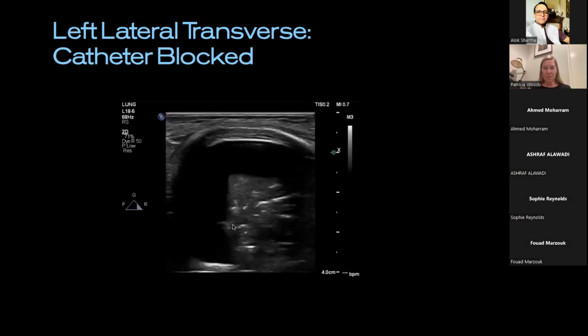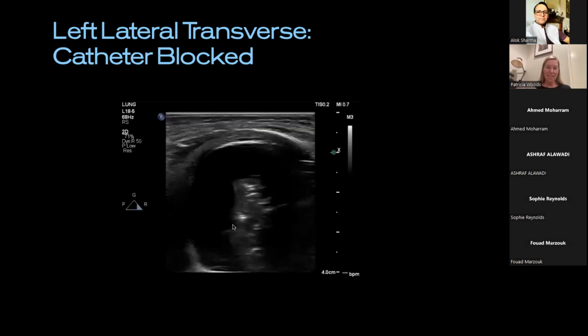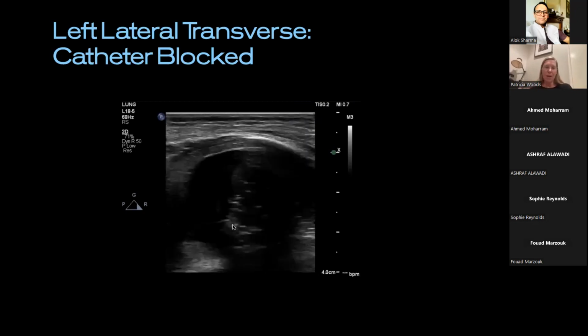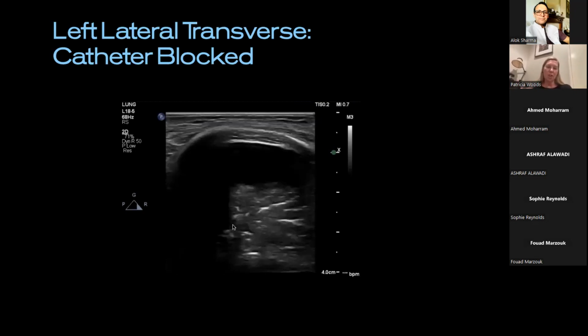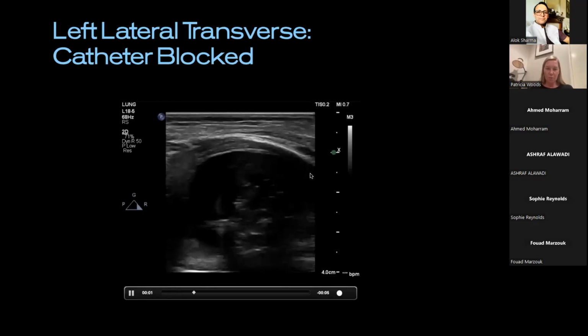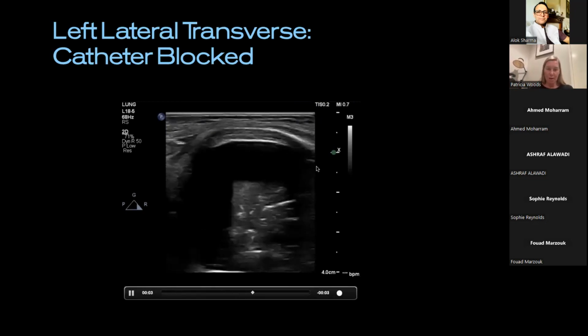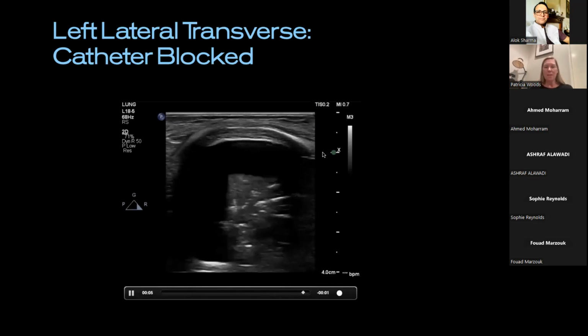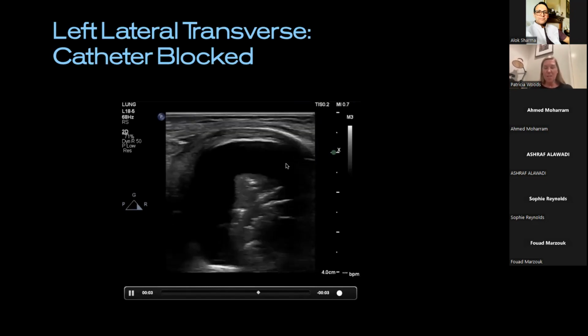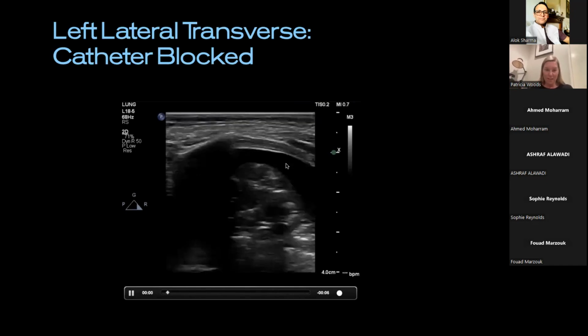Neither will X-ray, but you can have a look at the extent of compression, or non-aeration, and you can think about what you can do to change that. But what you might be observing here, if you look really carefully, occasionally, is this parallel-like structure, that is my chest catheter traversing that space. So essentially it was just blocked, which is common, isn't it?